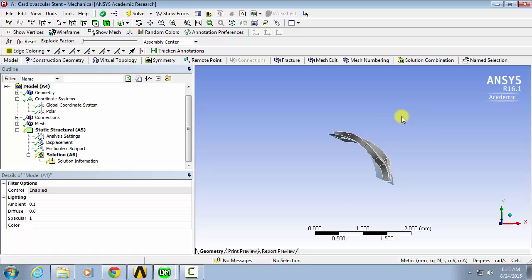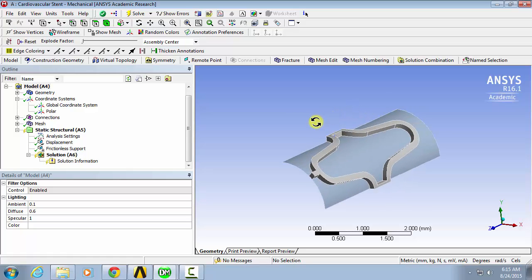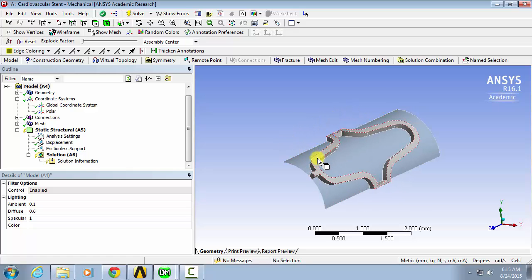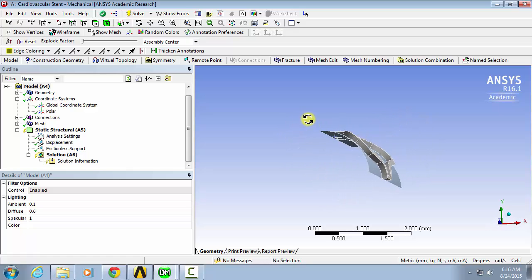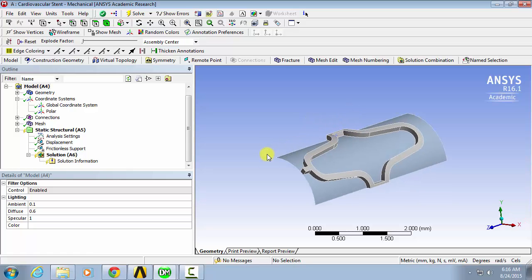The peak stress, which is the maximum stress at the maximum expansion, and the residual stress, which is the stress that's left over after the stent collapses and deforms.